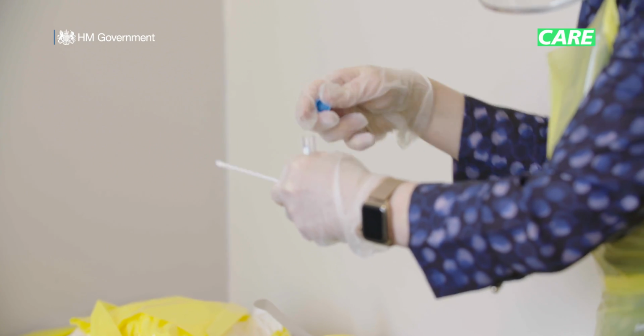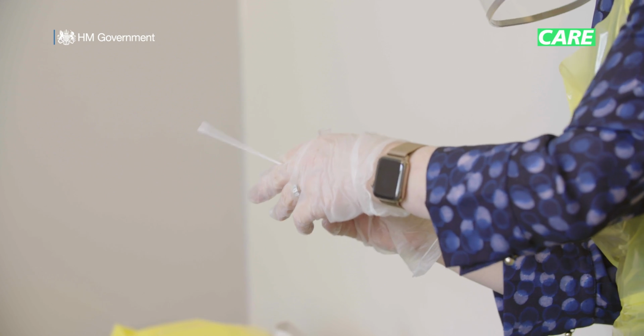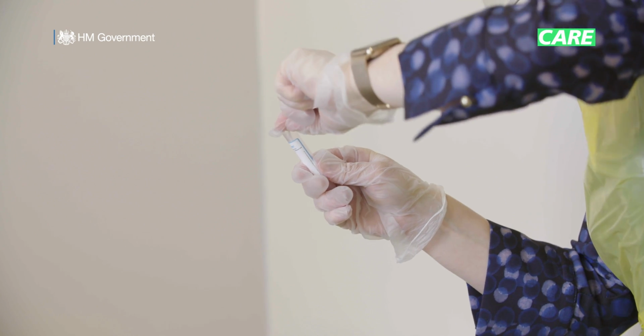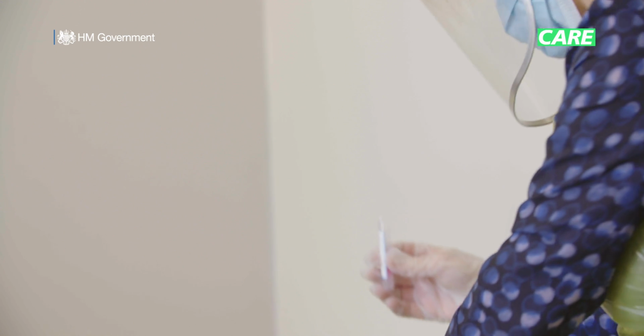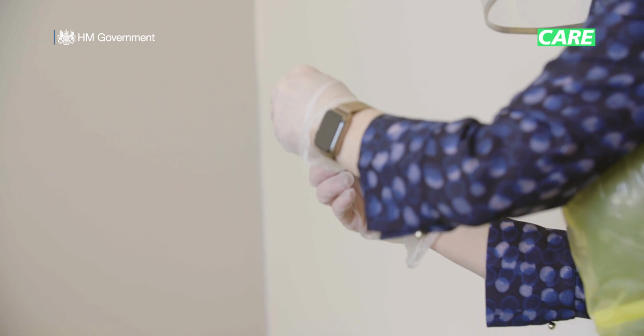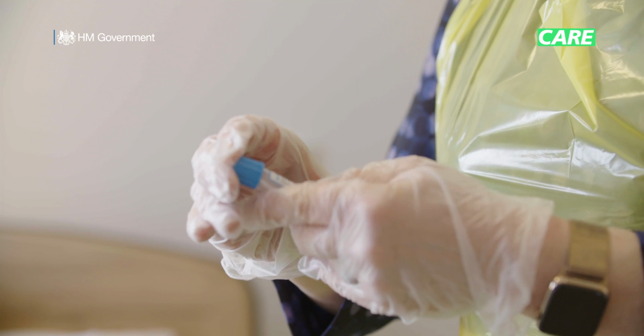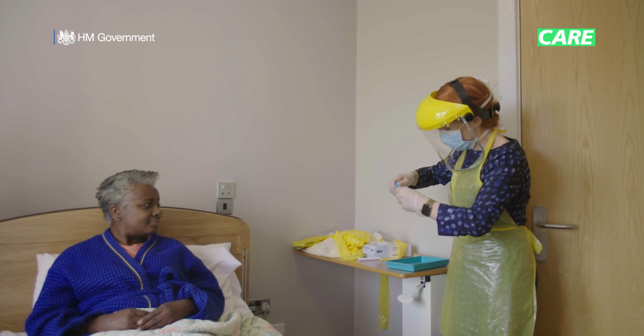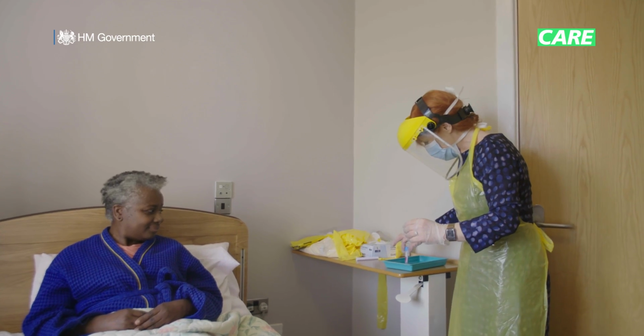Carefully place the swab into the plastic vial with the fabric tip facing down and snap off the other end of the swab at the break point so that it fits in the vial. Place the lid back on the vial, making sure it's securely fastened shut. That's all there is to it. The swabbing's complete, and now you need to get the package ready for the courier to collect.